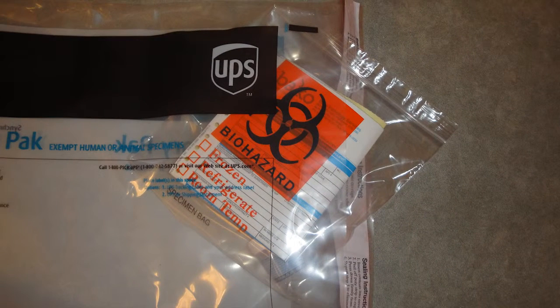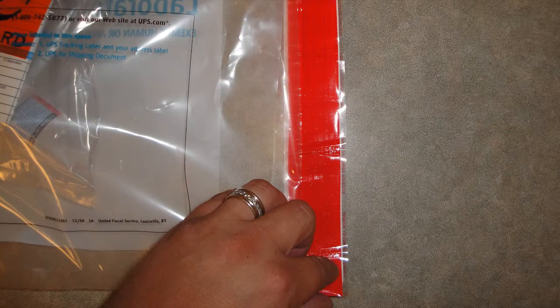The biohazard package with the specimen, demographic sheet, and pathology orders will then be placed in the pack, and the pack is to be sealed by pulling the red material strip. This will uncover adhesive that can be turned over.